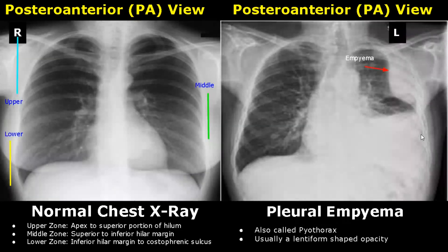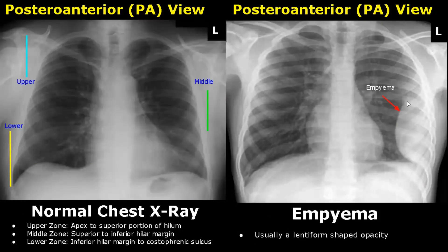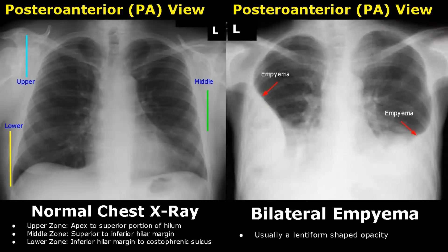An empyema is defined as accumulation of pus within the pleural cavity. The opacity usually has a lentiform shape, which is a bi-convex shaped opacity. This is an image of an empyema in the left middle and lower zones — the opacity has a specific lentiform shape. We can see bilateral empyema in this image, with two lentiform shaped opacities, one in each lung.